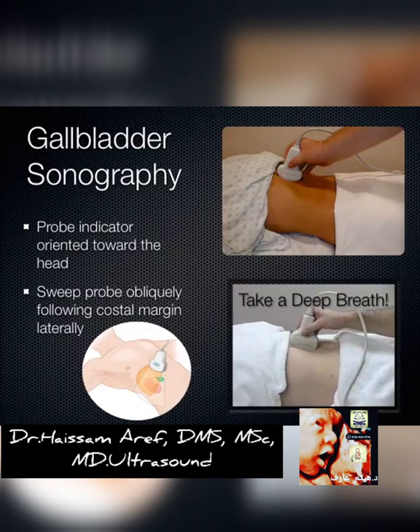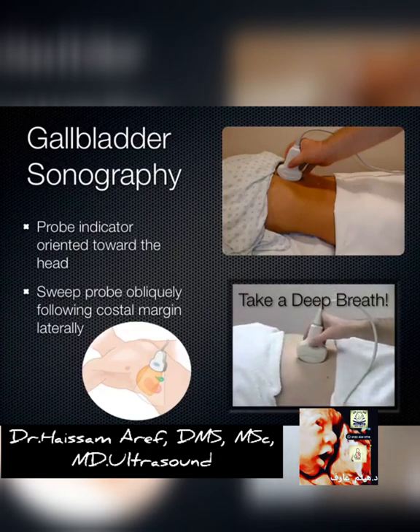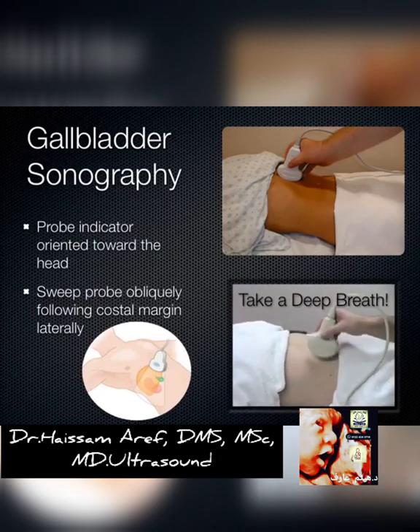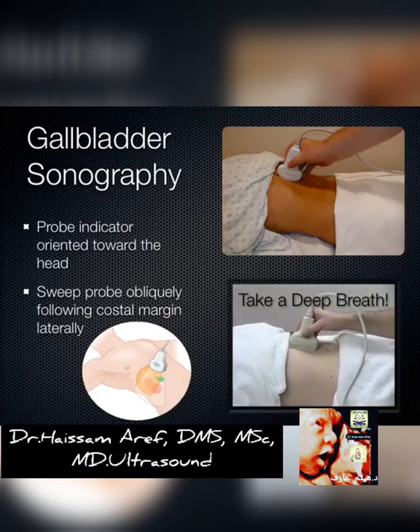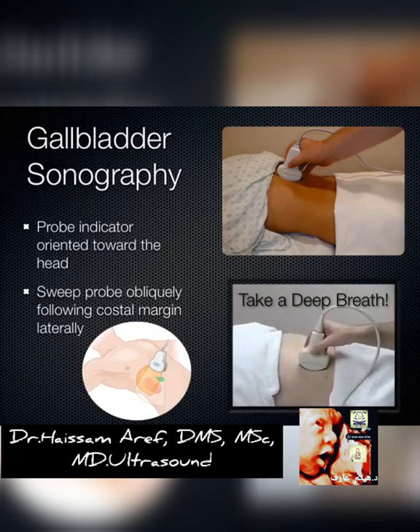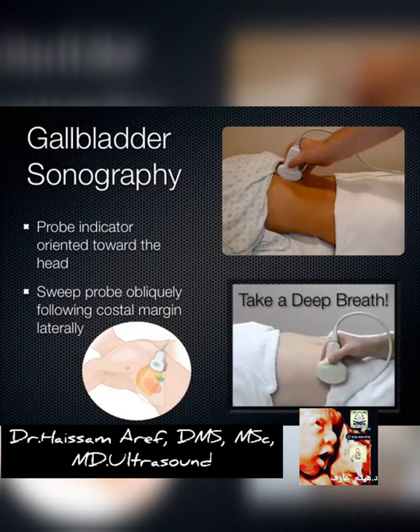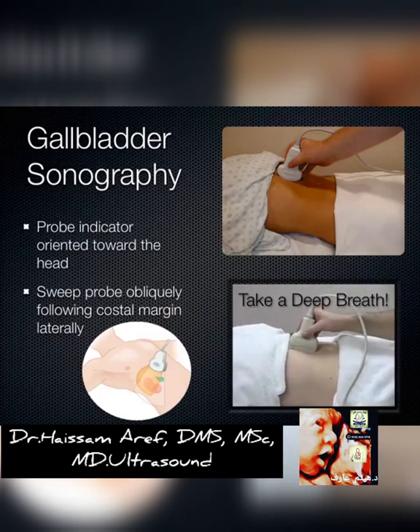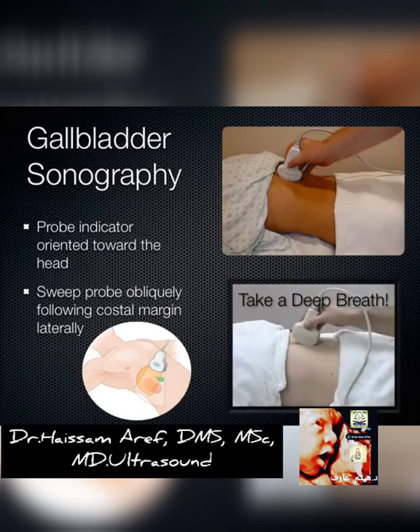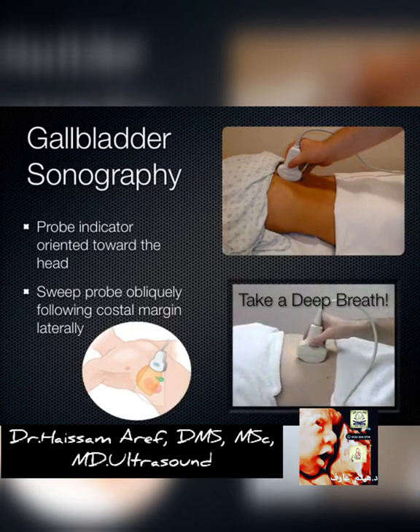Moving on to the gallbladder — this is gallbladder ultrasonography 101. What you do is a subcostal sweep: take the indicator and aim it toward the patient's head, have the patient take a deep breath, and follow along the costal margin. There are so many anechoic structures on the screen that you need a landmark to identify the gallbladder.